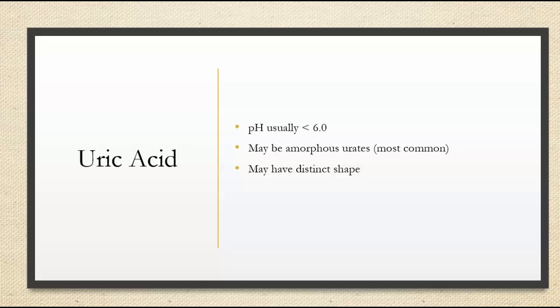And they typically are going to cause problems when you are trying to do your microscopics, because if there's a large amount of them after it's been standing for a little while, it can basically cloud your whole field, and it just looks like you're looking under a microscope that's full of dirt. So typically a little warming, if you put it into some warm water, it will help dissolve that.